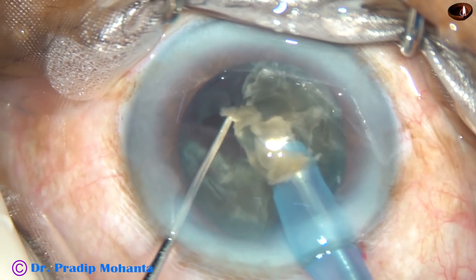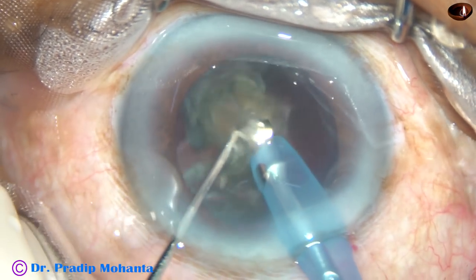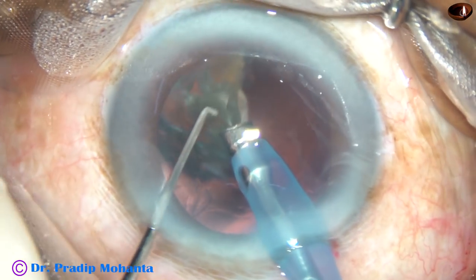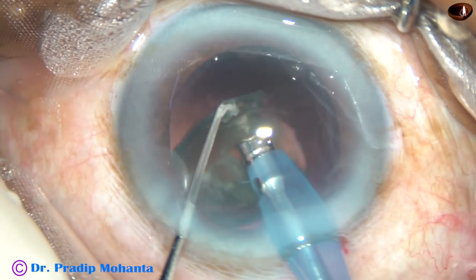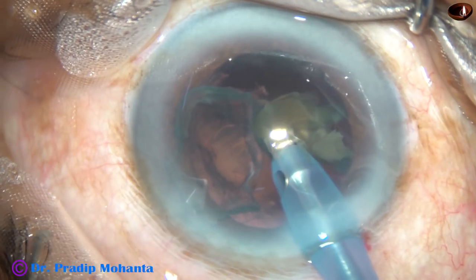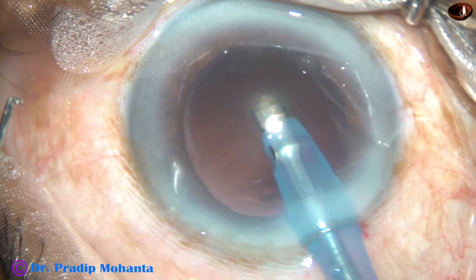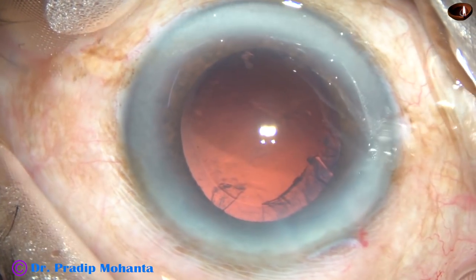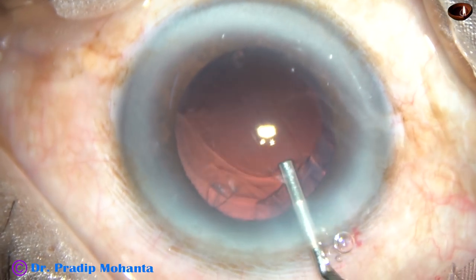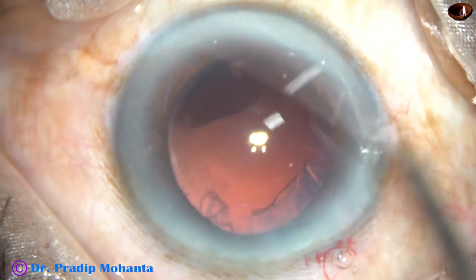The nucleus is being nicely managed. This is the last nuclear piece — start emulsifying from the apex. Take care that the apex doesn't go posteriorly and hit the posterior capsule.